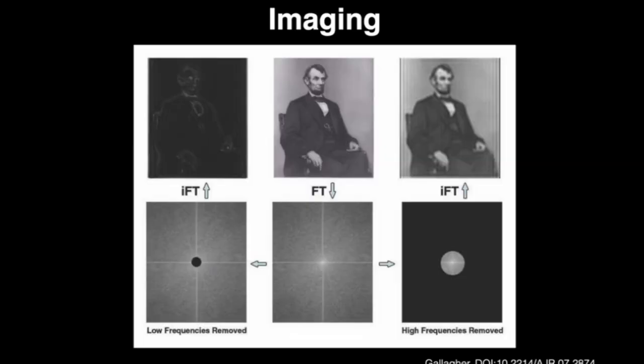And that's shown when you take this image and break it up, take away different parts of the Fourier space, and then try to reconstruct the image from those. So on the left, you take away the center. Then most of the brightness, most of the energy in the image is gone, but the information that encodes the edges is still there, so you can see the edges in the portrait. Conversely, if you take away the edge information but leave just the center, you keep most of the energy and you have things that vary more slowly over space. So that's why you're getting some blurring here.